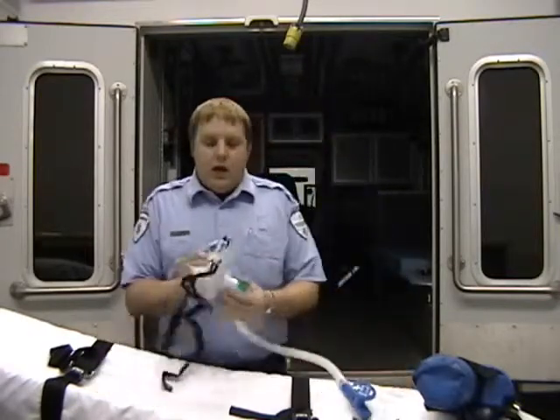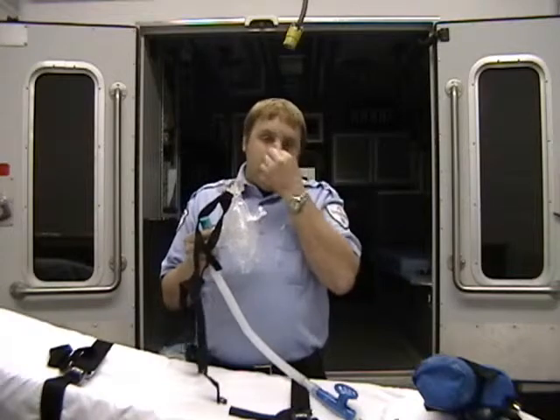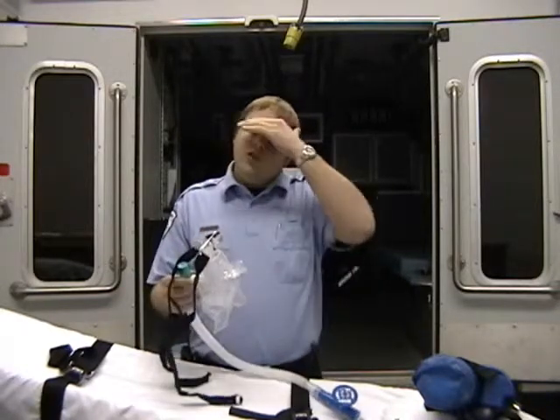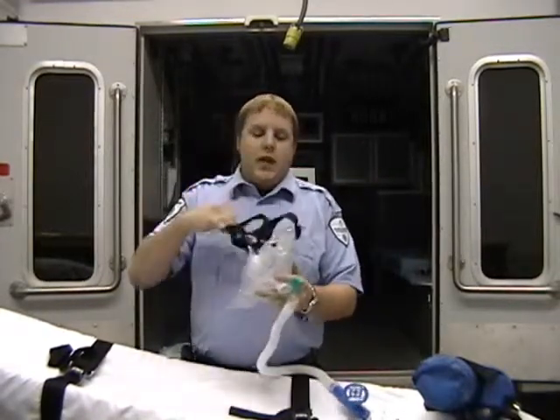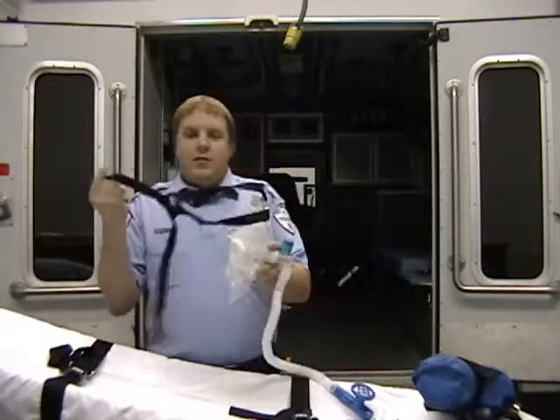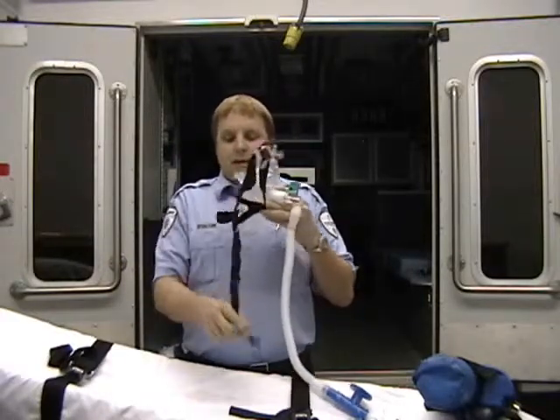Once the oxygen is flowing, you can apply the CPAP to your patient's face and make sure you get a good seal across the bridge of the nose and across the cleft of the chin. And these pads should rest on the patient's forehead. Once the patient has this on their face, you will then attach the head strap by placing it behind their head, bring the side straps around to the front and locking them into the front of the mask.